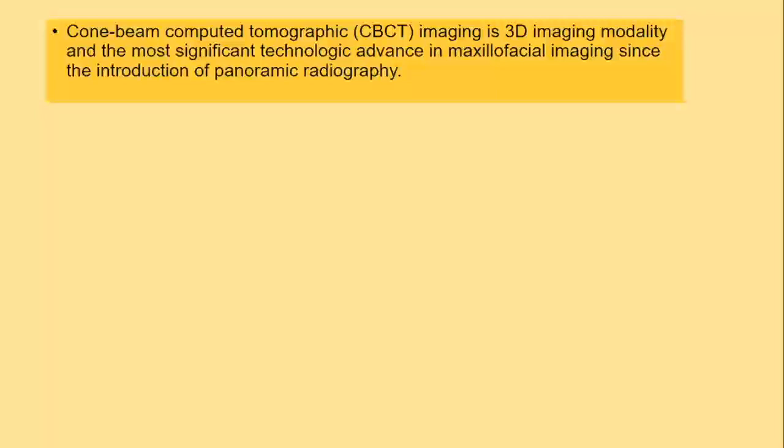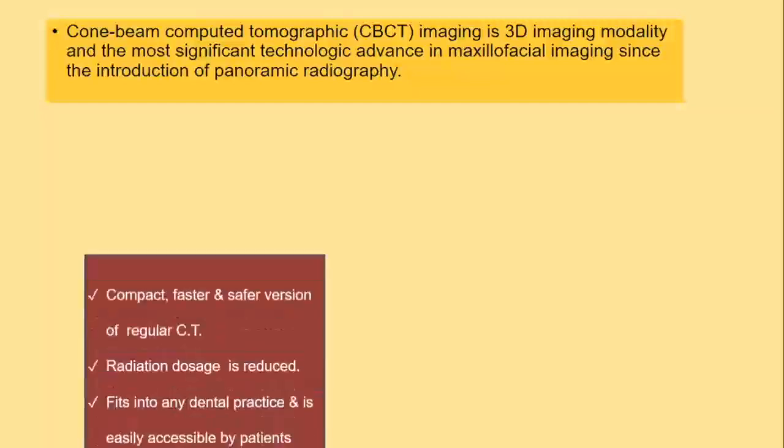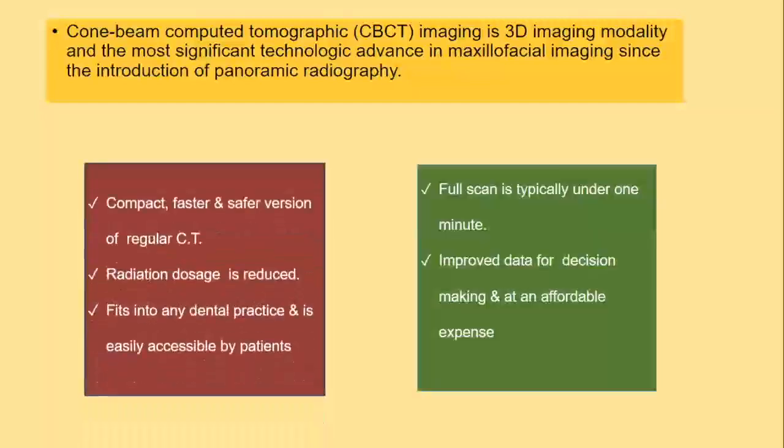That's a wonderful statement to make. They said it's an advance in maxillofacial imaging since the introduction of panoramic. So from panoramic, CBCT is now the most advanced. It's faster and, most importantly, fits into any dental practice. Very accessible to patients compared to going for a CT scan. We all know how difficult it is to go for a CT scan of head and neck. So now we have a lot of migration, especially of maxillofacial surgeons sending us patients from CT scans to CBCT. But a small point I'll make when I go to trauma.